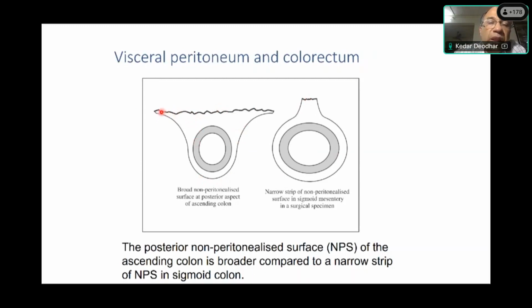But it will sometimes be prudent to look at this: if you have a tumor which is circumferential, anteriorly we'll have a serosa, so we're looking at PT4, and posteriorly we look at circumferential excision, even in ascending and descending colon. Of course, we'll discuss this in much more detail in the rectum.